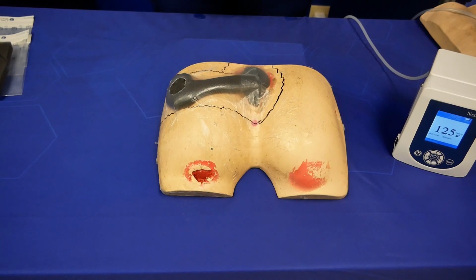Once we've completed our dressing application and we have to document, it's imperative that we document how many pieces of foam are used. So you want to focus on the color of the foam that you've used, the number of each one of those that you've used both inside and outside of the wound.